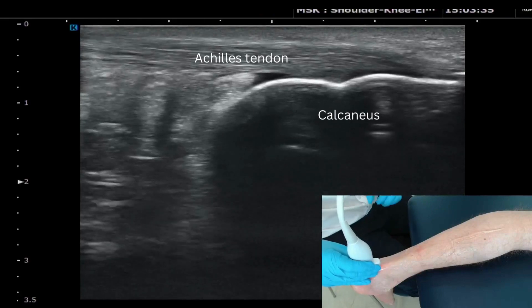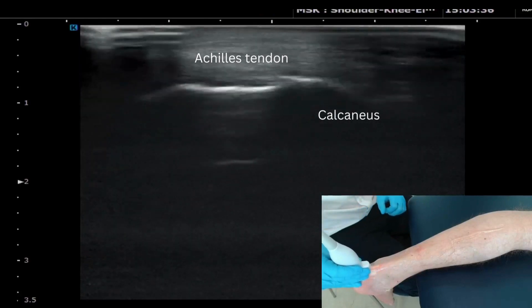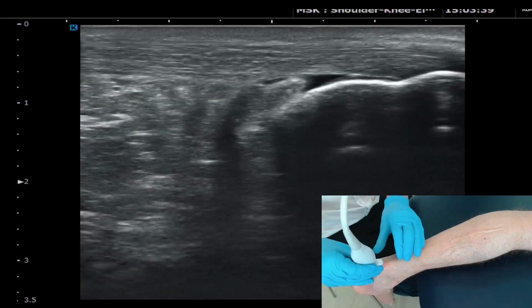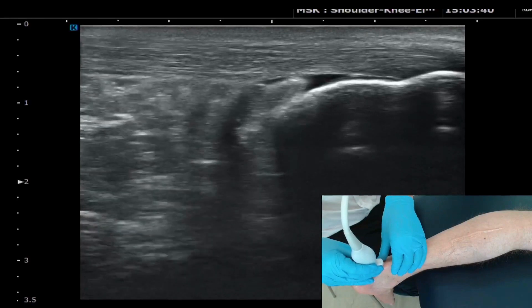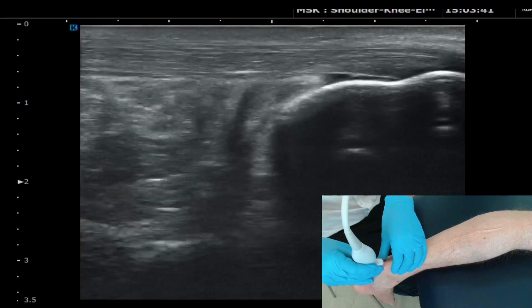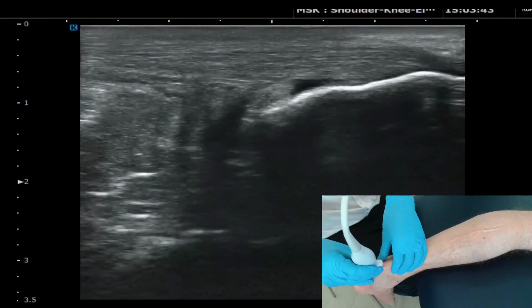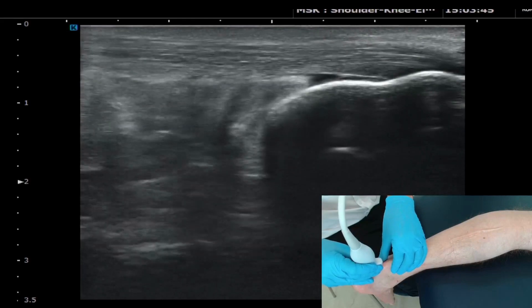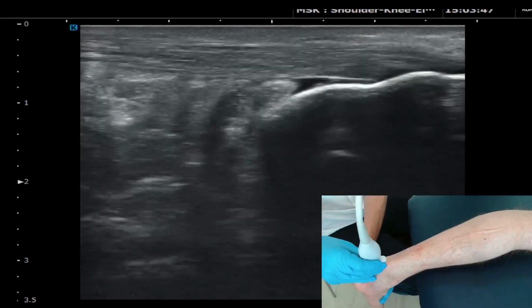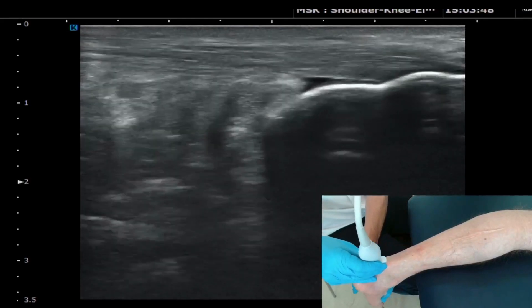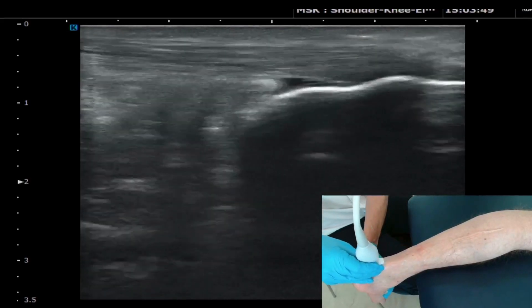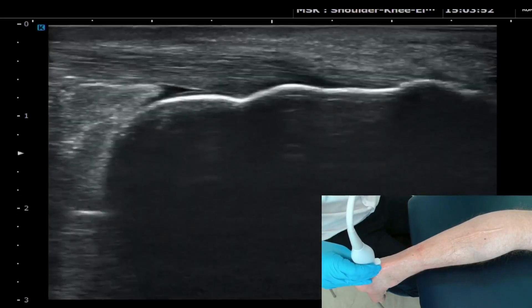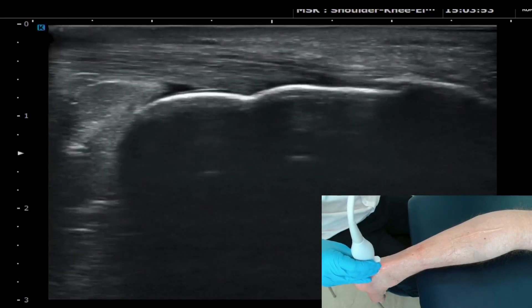On ultrasound we can see the bright white mountain that is your calcaneus or heel bone, with the Achilles attaching to it. We can also see the retrocalcaneal bursa sitting deep to the Achilles, with a normal amount of anechoic or black fluid within it — that's a normal amount, it's not pathological.